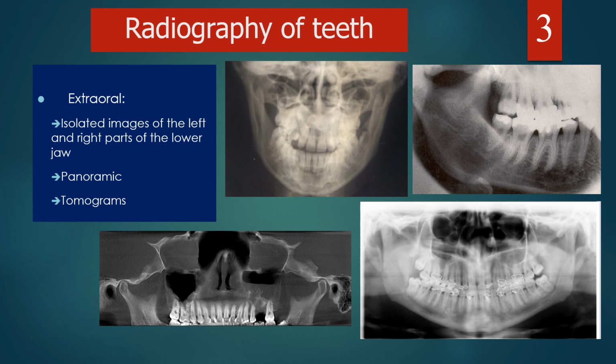It is extraoral radiography. We can have isolated images of the left and right parts of the lower jaw. We can take the panoramic view and we can make tomograms.